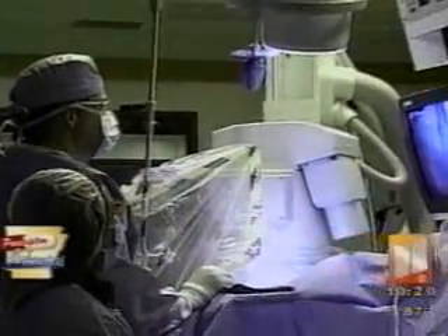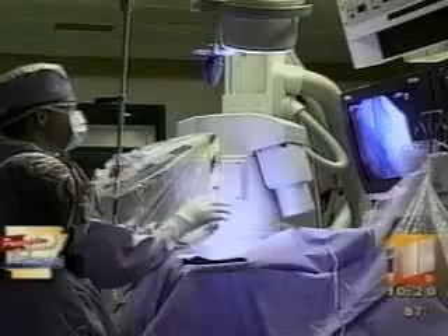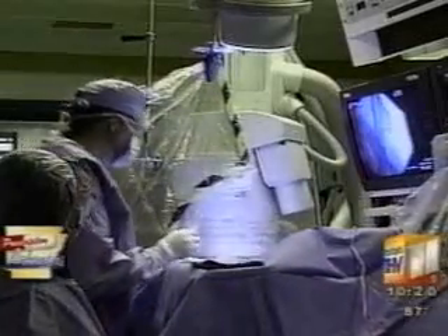Dr. Randy Minton was able to use a device called the Silverhawk to remove the problematic plaque. 'We put a catheter in at the bend of the leg that's no bigger than a coffee straw, and everything we do is through that little catheter, which comes out after the procedure. It uses a rotating blade to shave away the plaque, collecting it at the tip and removing it from the artery.'